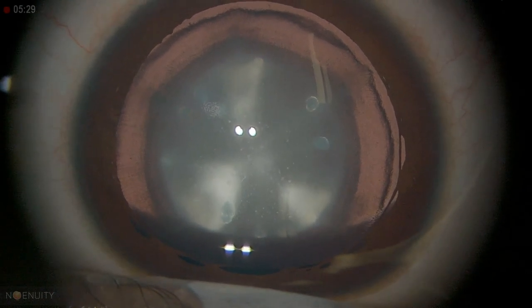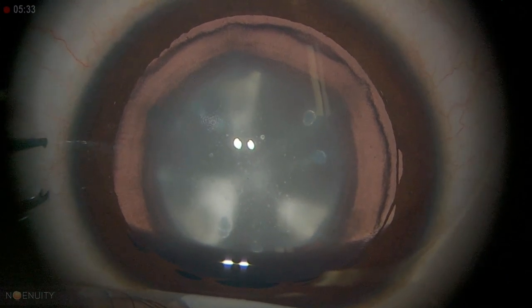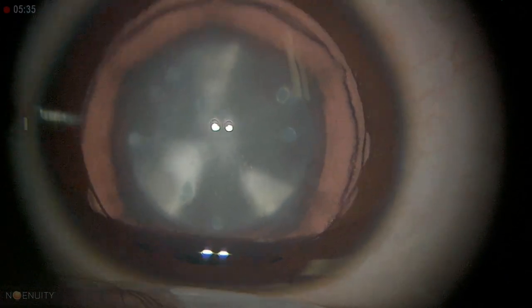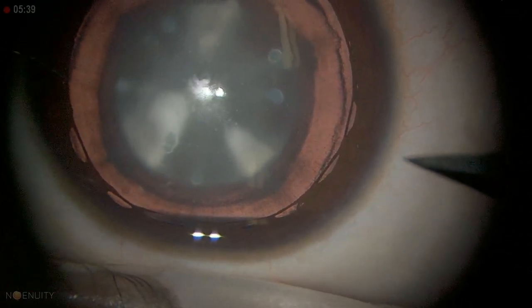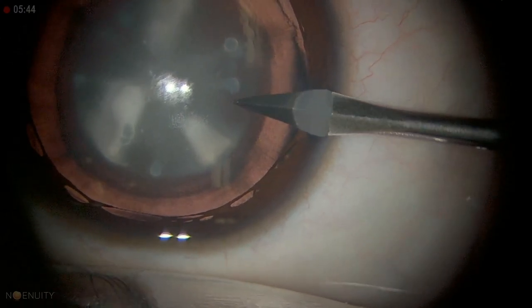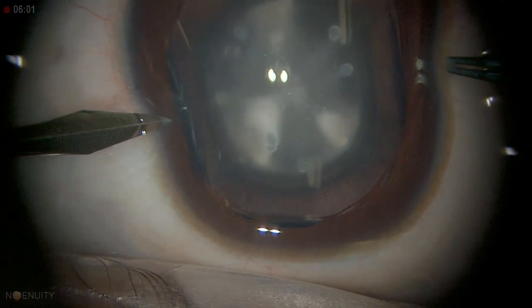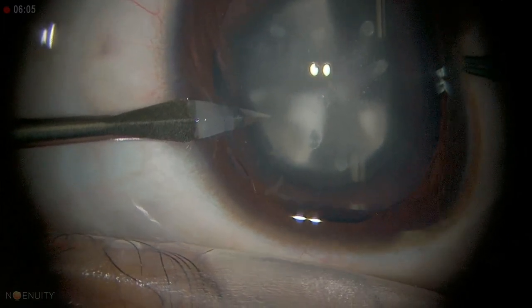The patient is four years old with bilateral cataract — the morphology is similar on both sides and it is developmental in nature. We are going to do lens aspiration, primary posterior capsulotomy, anterior vitrectomy, and implant a lens in the back. Once I have done the stab incision, we will proceed.